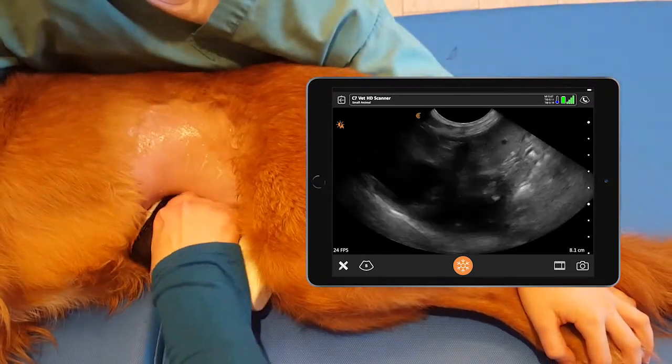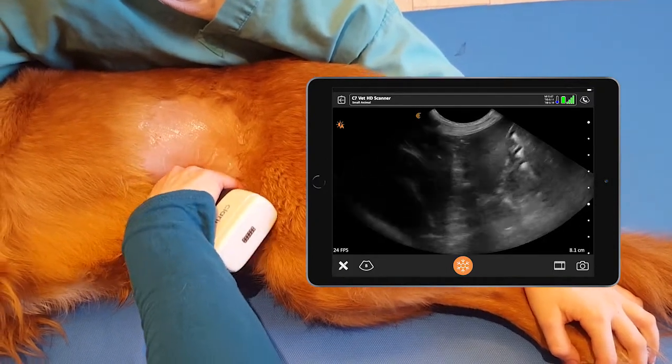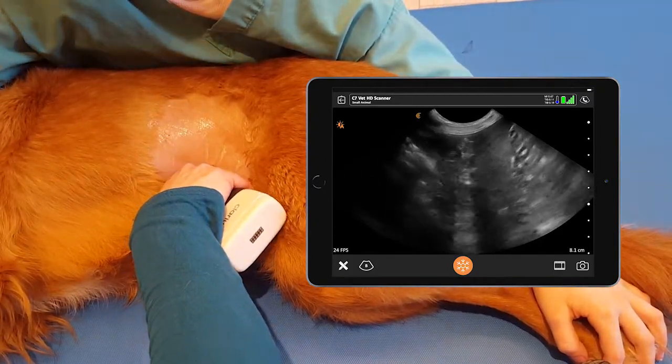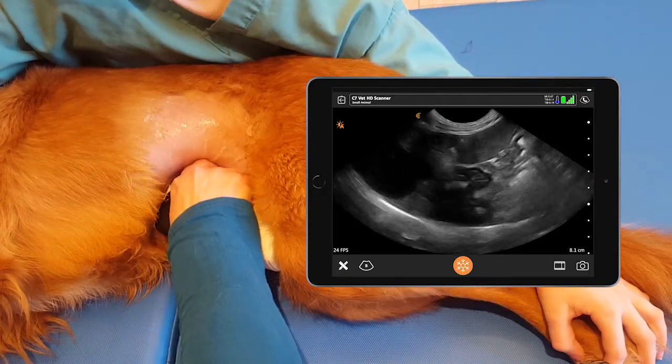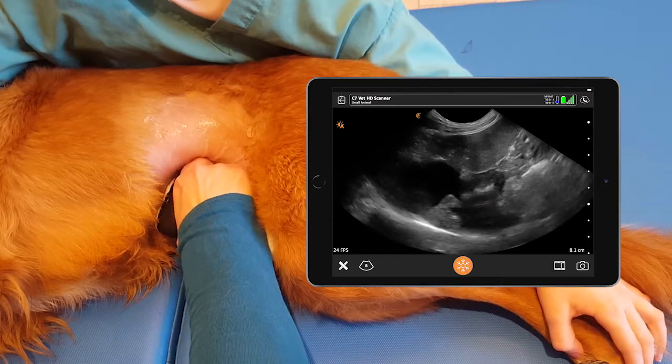When we're fanning down, we will get to see any stones, sediment, or sludge that has fallen to the gravity-dependent side of the gallbladder.